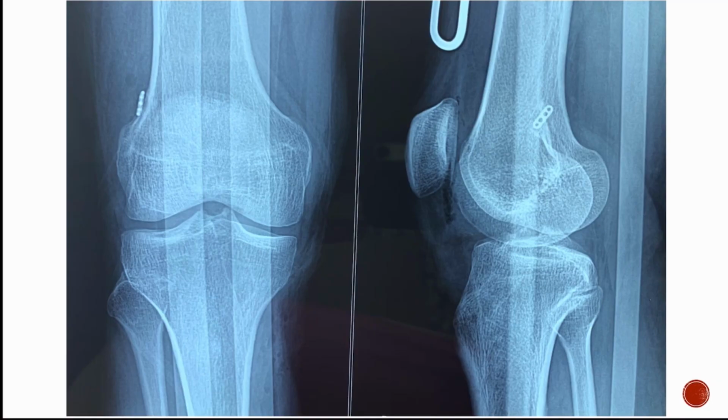This is the post-operative X-ray, and as you can see that the endo button is nicely flipped here over the lateral femoral cortex. I skipped the rest of the surgical steps because otherwise this video would have been too long.